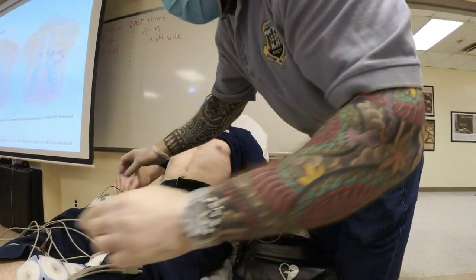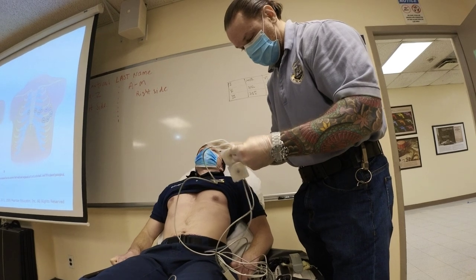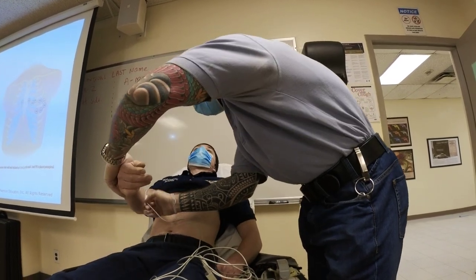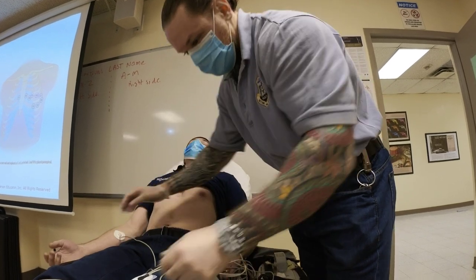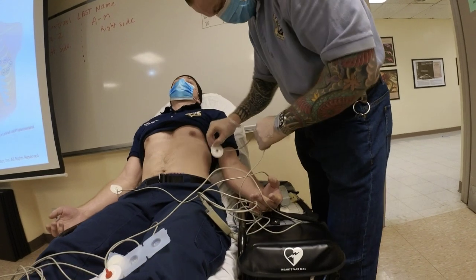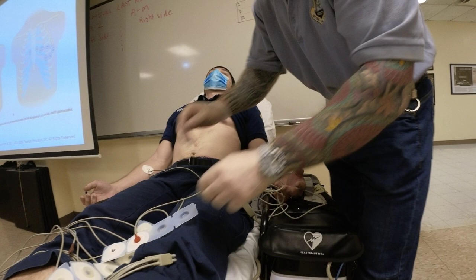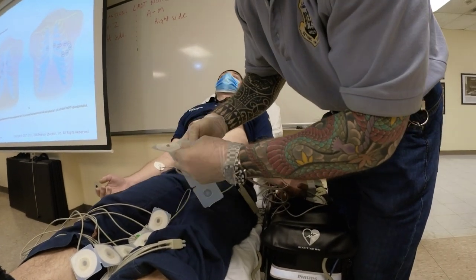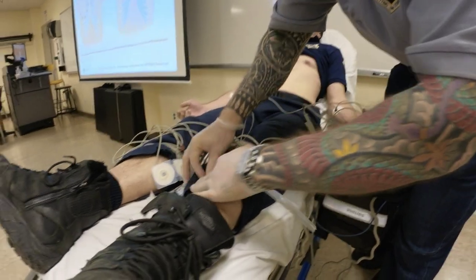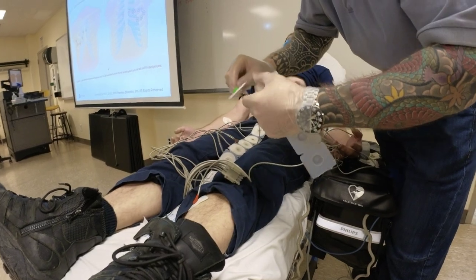Look at her. So, guys, pay attention, right? So we start, what I say, salt, pepper. Because this is a young guy that's getting naked in front of me, not an old guy. Salt, right? Then we do pepper. Ketchup. And then the relish, as I said, was on the pectoral leads.